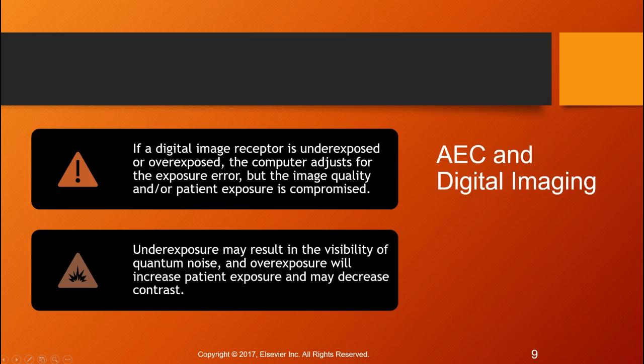Underexposure also may result in the visibility of quantum noise. We've seen this in our lab. And overexposure will increase patient exposure and decrease contrast. Okay, so positioning is essential. It is key in automatic imaging systems.